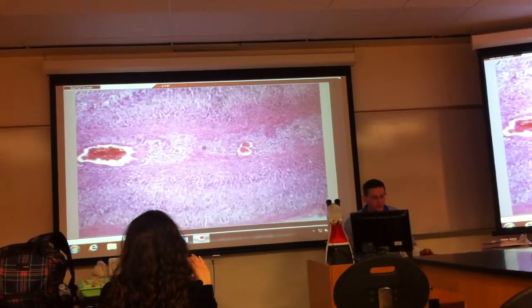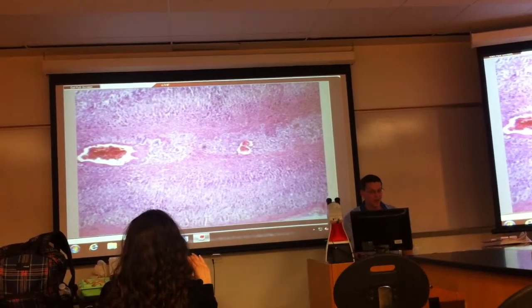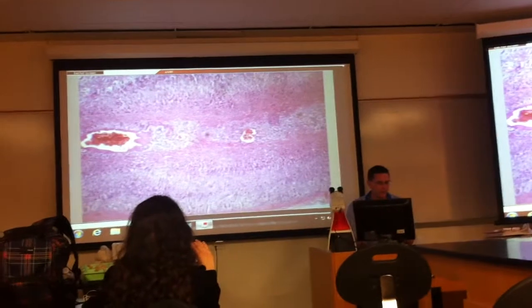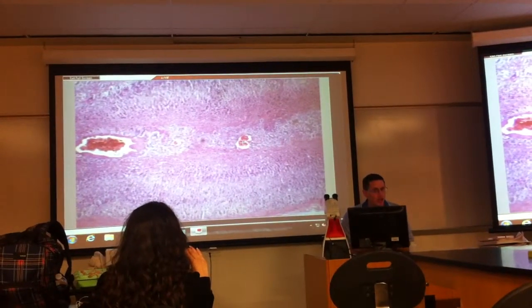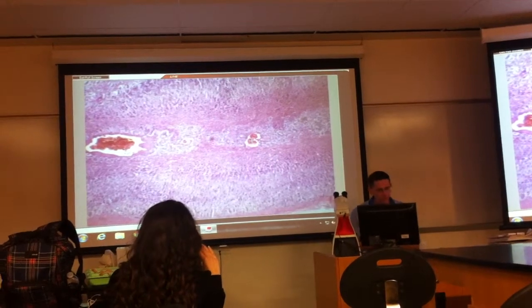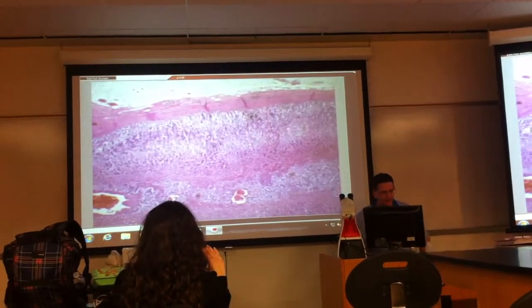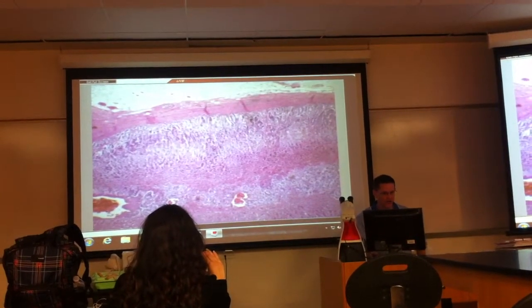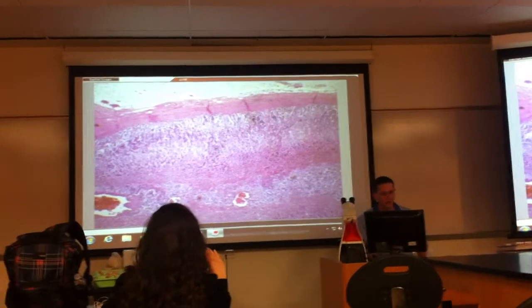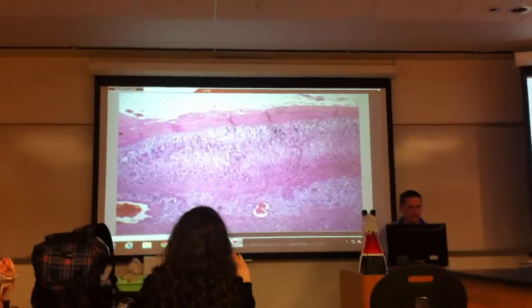So the easiest way to identify the medulla, because I know these layers start to get into each other, most of the time it's got these big blood vessels in it. So when you see those big blood vessels, that's a very good hint. You're probably looking at adrenal medulla. Certainly when you see capsule, you know the part that's touching that is part of cortex, right? The difficulty is how far down does it go? And that's partly just sort of look at those vessels and some other things.